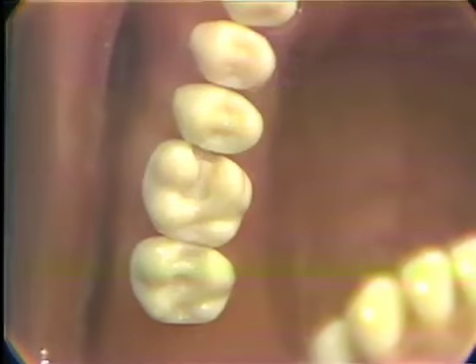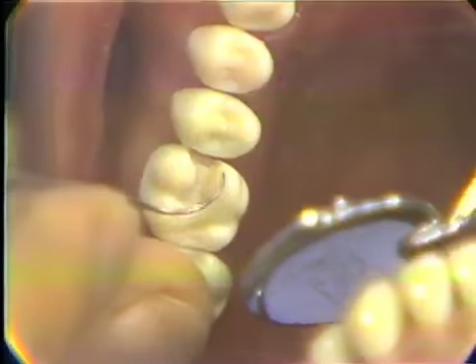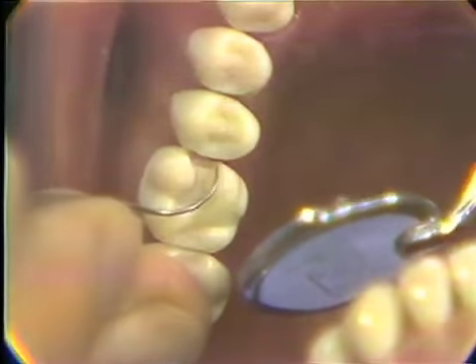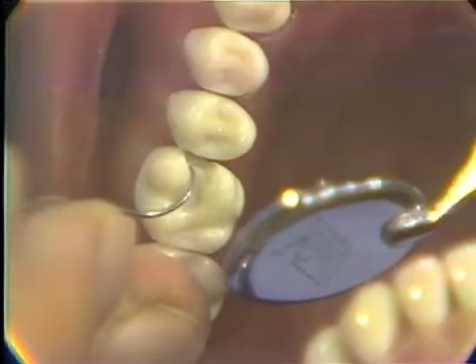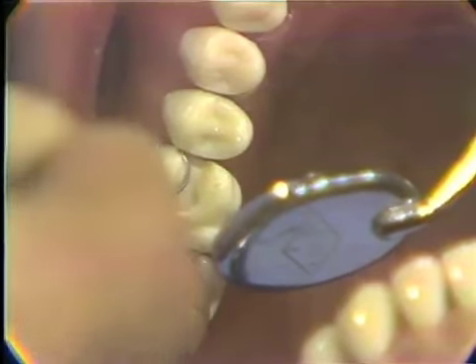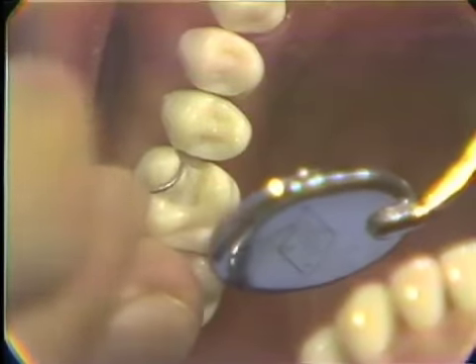After the use of the hand instruments, we should check the cavity preparation again. As you will notice now, there is extended flare on the lingual, and that's what we were after. The buccal still is flared the same as it was, and yet it is brought out further toward the buccal to give us that freedom that we require for our disc.